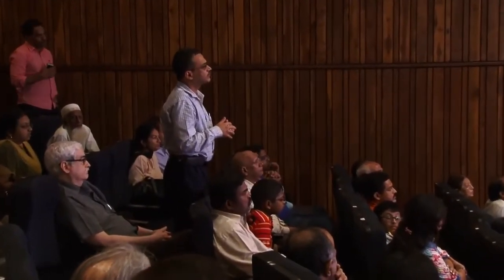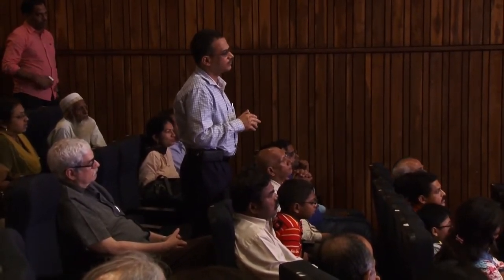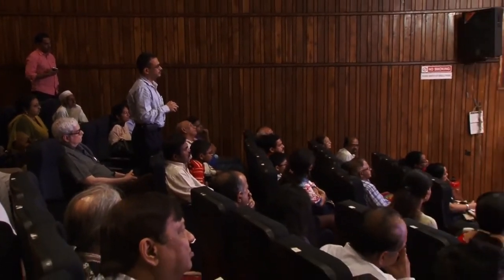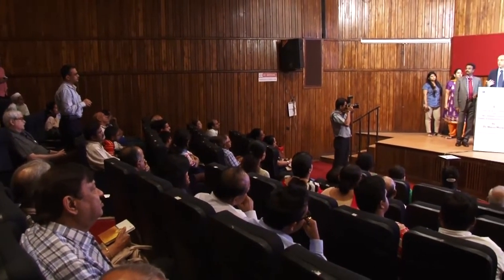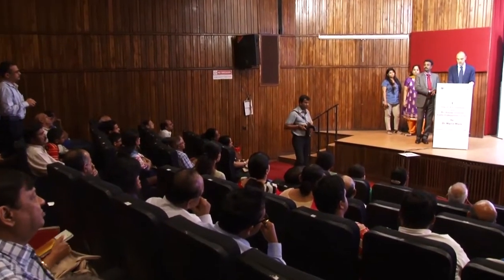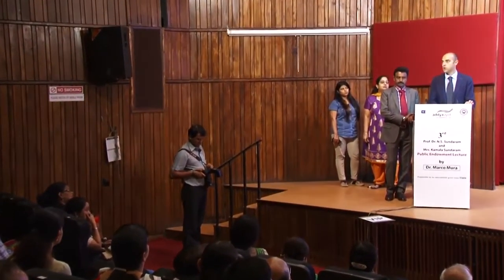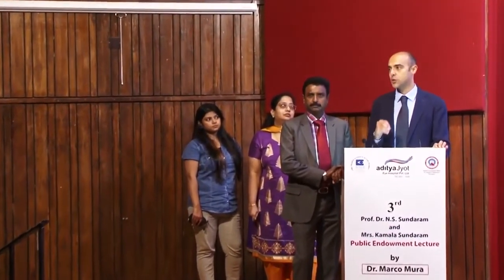Yes, look, age is not a problem. As you can see, there are also people in their 80s who are implanted. The most important things are two. At the beginning we didn't do it, but now in the last generation of patients, we always let the patient be seen by a psychologist, who talks extensively to them to understand their expectations. Managing expectation is the primary factor which enables a good result.